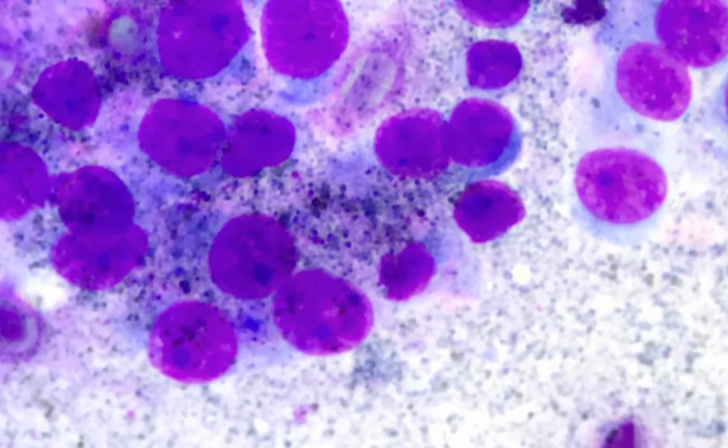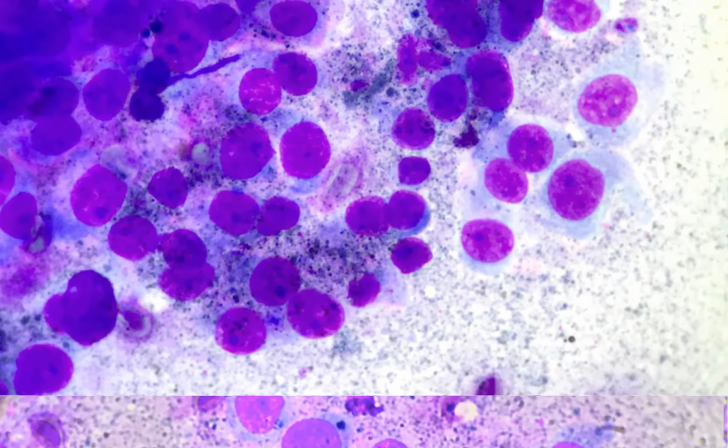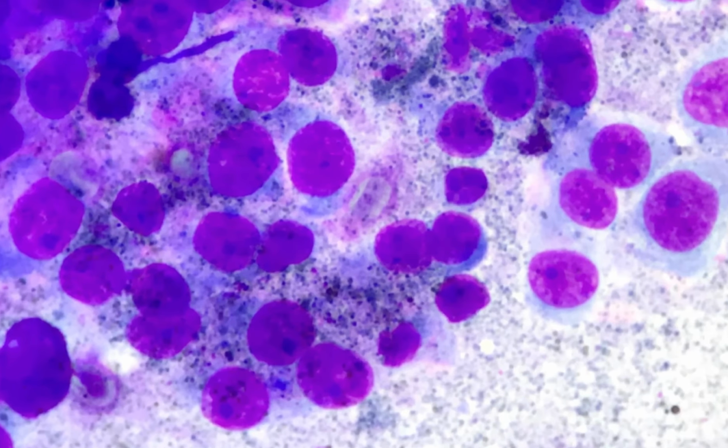And not all melanomas have granules. There is a separate category of melanoma which is called amelanotic melanoma, where you don't see any granules at all. And amelanotic melanomas tend to appear a lot like plasmacytoma.